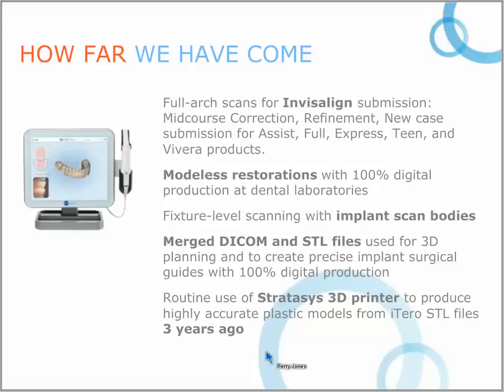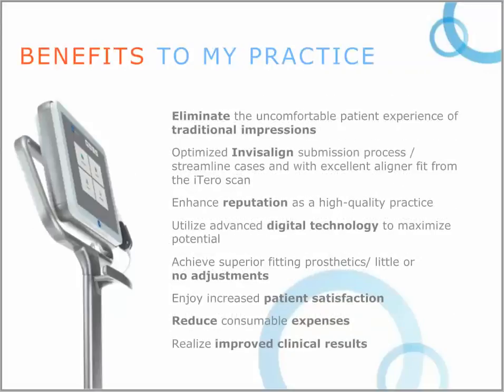We now use, and we'll show you guys in the future, the merge of DICOM files and STL files to create a virtual planning platform on which we can create precise surgical guides and place our implants, and even make our pre-planned immediate provisionals to be placed at the same time as the placement of those implants. And of course, the world is wide open for what we'll be doing in the future. Your world, your future, will be using digital scanners that will have a workflow with 3D printers. We're doing that currently in my office, and we'll talk a little more about that in the future.